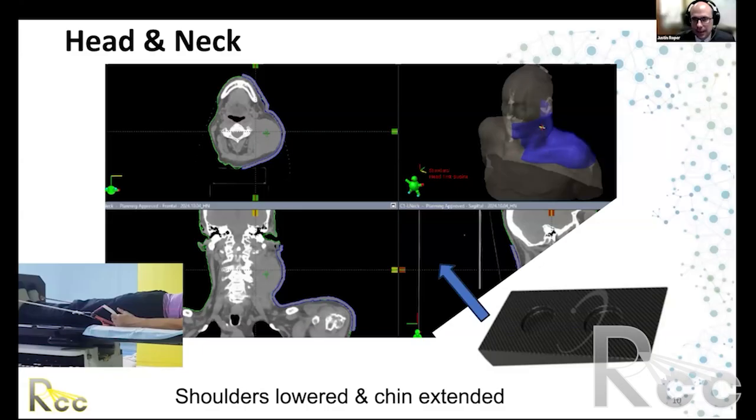Yes, that's such an excellent point. Head and neck patients will commonly lose weight over the course of treatment. In some instances, there can be substantial tumor shrinkage too, both of which can lead to air gaps. It is quite common in our clinical practice to monitor the patient for such changes based on a cone beam CT, and then when warranted, based on that information from IGRT, adapt. And so that adaptation could involve adjusting the mask to minimize the air gap. It may be a full-out replan with a resimulation to account for those differences.